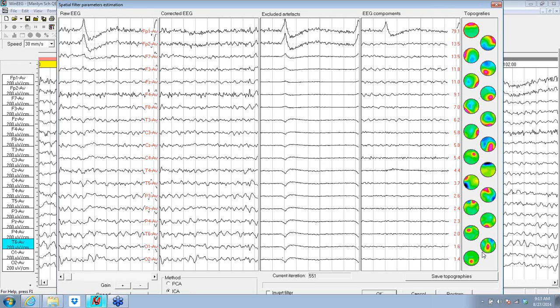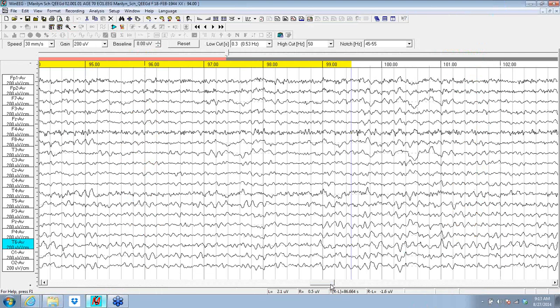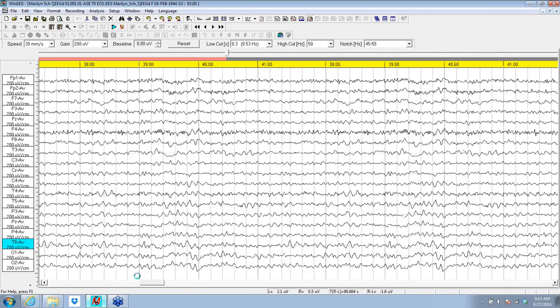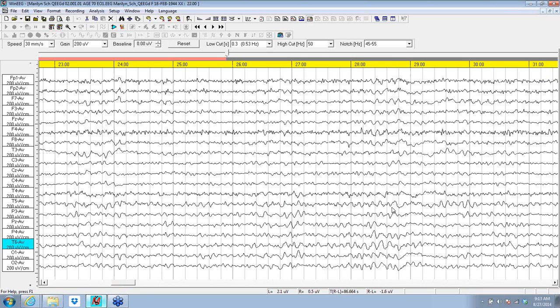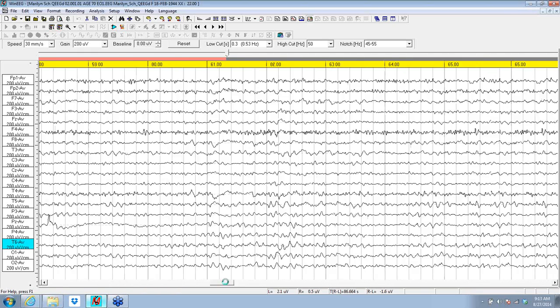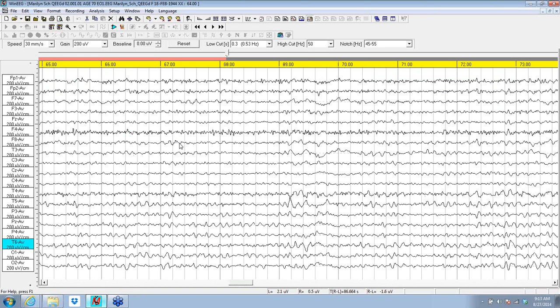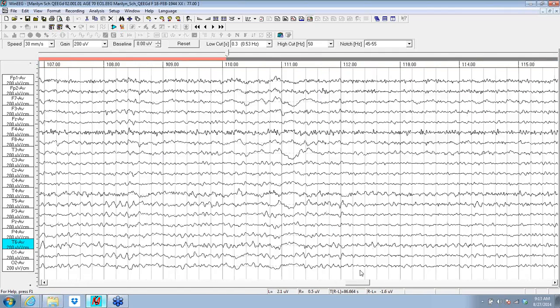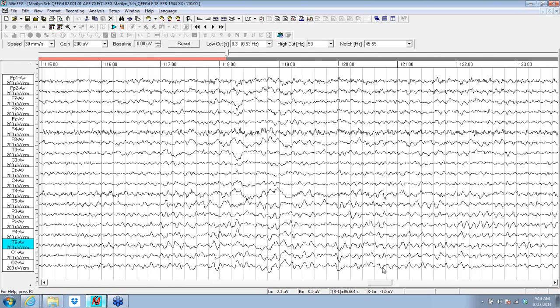Now, I can pick other components too, and on occasion you'll see a strong lateral eye movement or some other meaningful component that you need to take out. But this is now minus the eye movements. And if you can't see that there's still temporal slowing here, you need to see your optometrist, not your neurologist. So we've got an EEG that's full of independent temporal slowing. Now, the EEG is pretty well cleaned out. We've got a residual muscle tension running through in a kind of odd location, F4, but that's not that big a problem. We can kind of read around that little fast buzz as we're looking at the EEG.